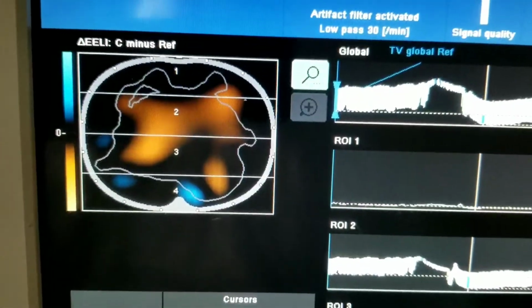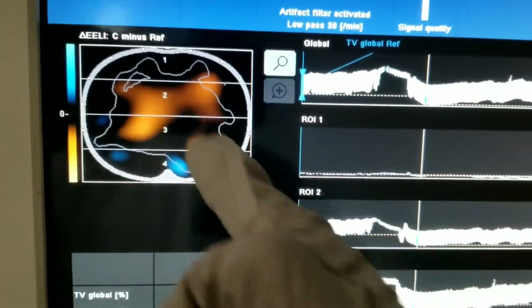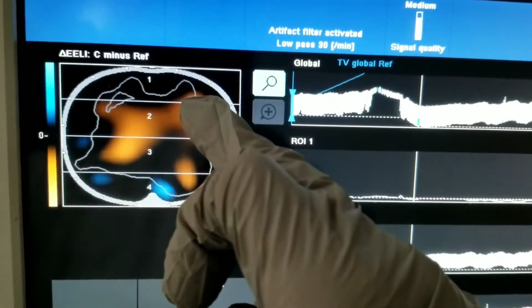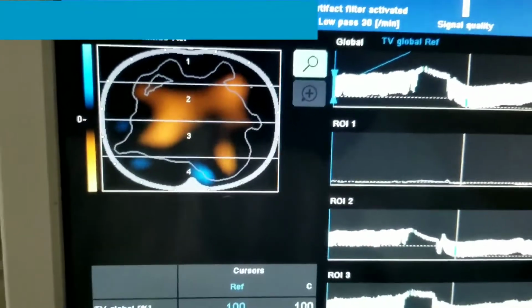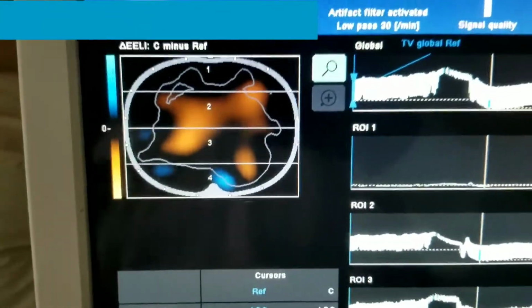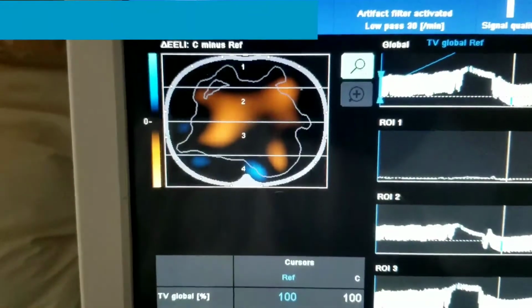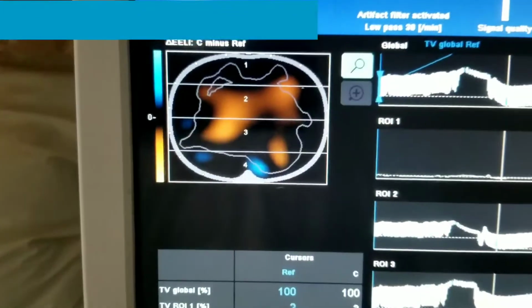Okay, so here, this is good. So we decreased the P high, right, and we're losing volume here in the higher ventral regions. This could be indicative of the previous setting creating a loss of compliance. So that's a good move.